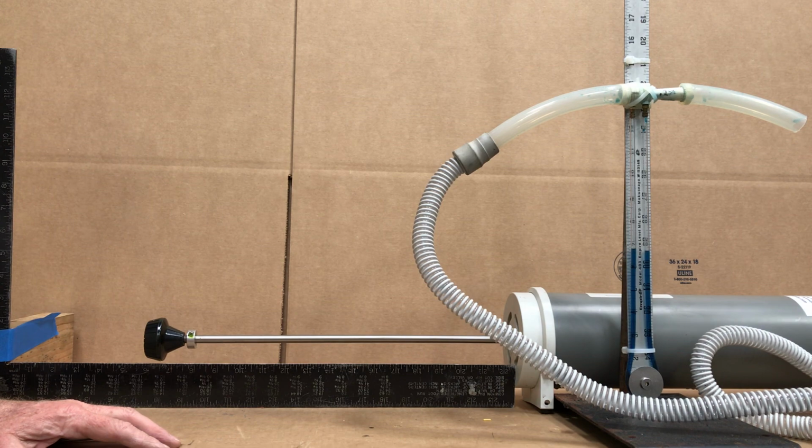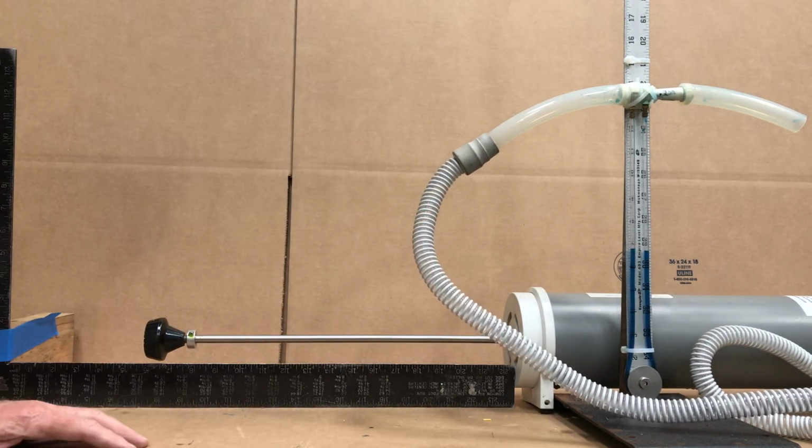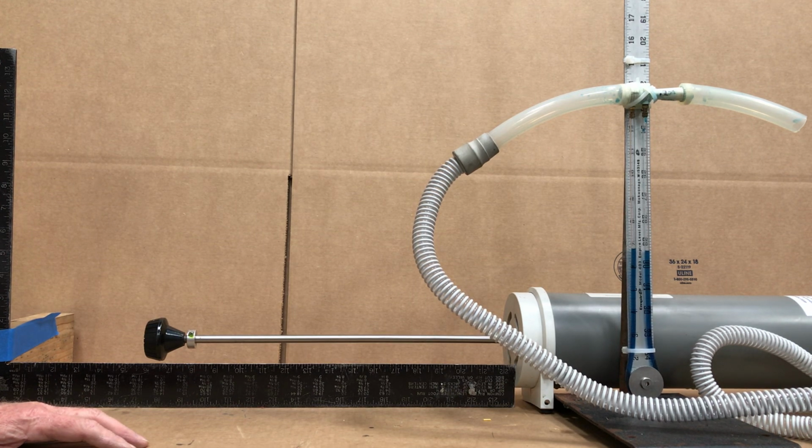And we want to analyze the data, that is the difference between the height in these two columns, which is proportional to the pressure drop across the Venturi. And we want to use that data to calculate the total volume flow rate of a breath.